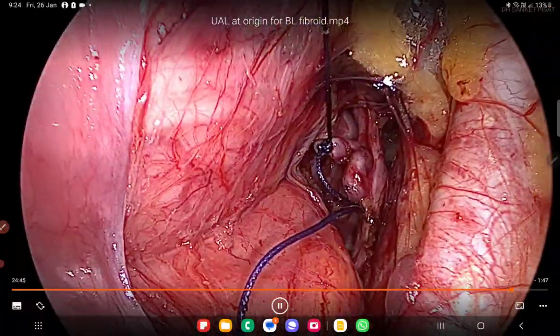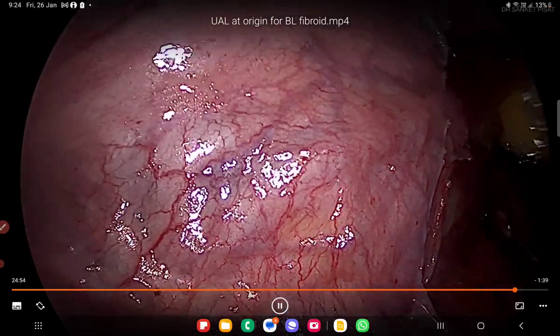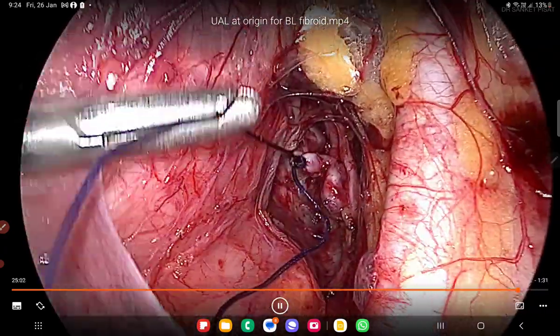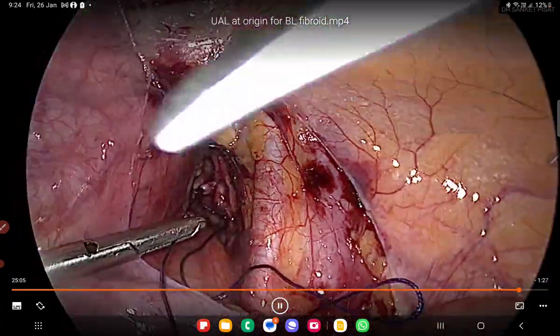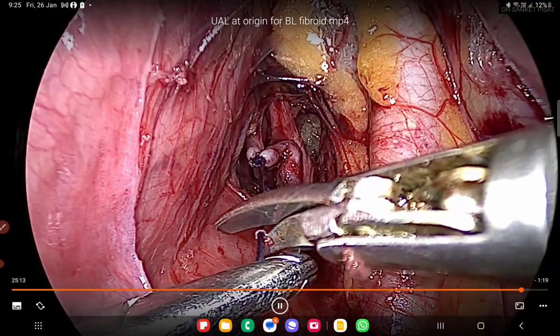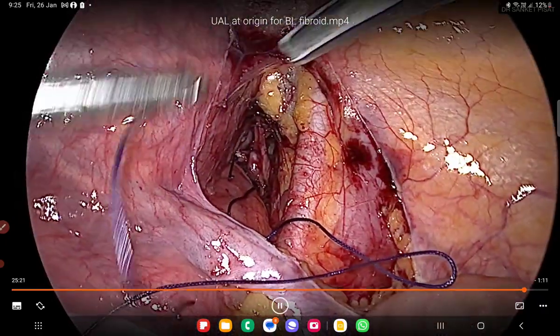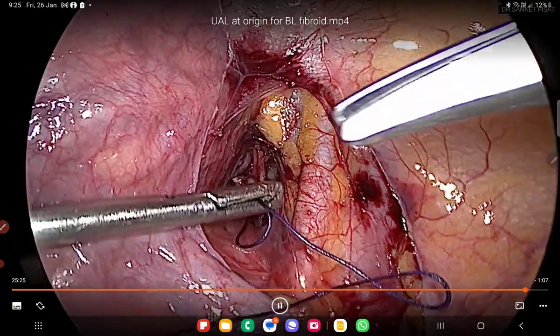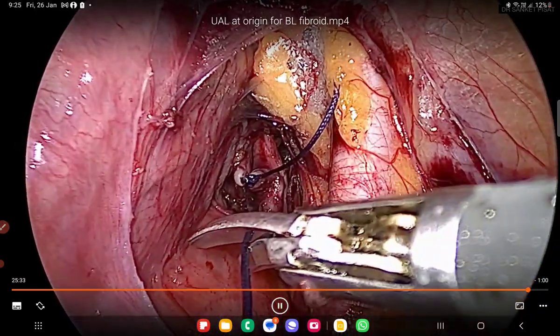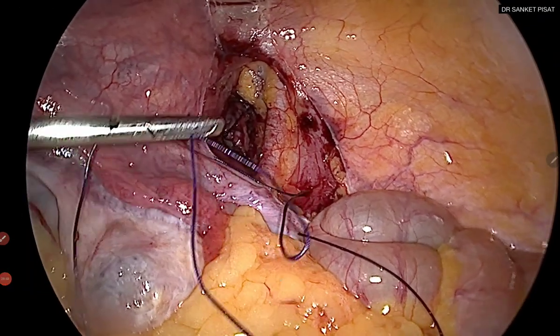The uterine artery has been ligated on the right side. On the left side I do not need to do anything similar because the approach seems to be quite easy. Even if I cannot reach the uterine artery on the right side during hysterectomy, there will be no torrential bleeding and I will be able to manage the case with or without enucleation of the myoma. Remember that uterine artery ligation at origin is a selective surgery — by no means should its unavailability prevent you from performing laparoscopic hysterectomy. It is an essential skill, but you can still do safe laparoscopic hysterectomy in most cases without retroperitoneal dissection.